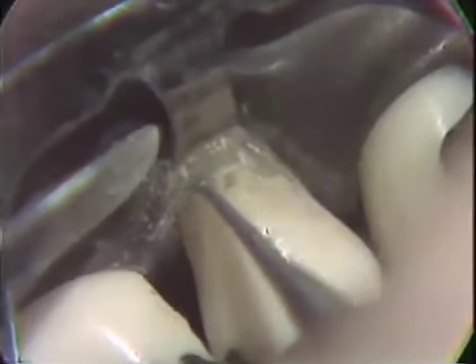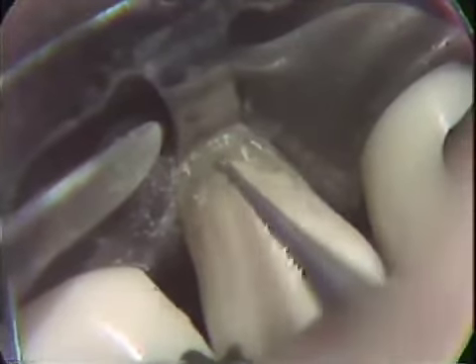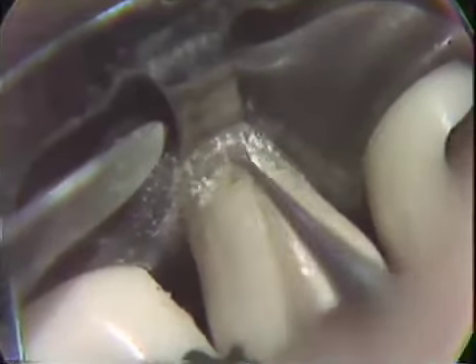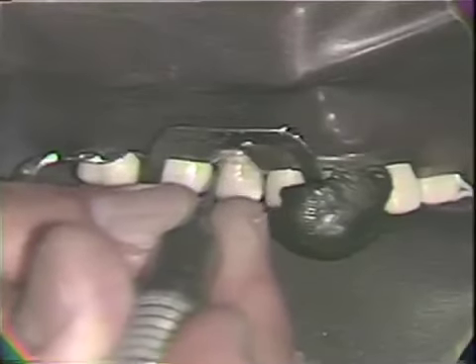Again, we're essentially in dentin, this being just beyond the cemento-enamel junction. Once that wall is formed, we'll then use the base of the burr against the axial wall in order that we might use the side of the burr in establishing the occlusal aspect.